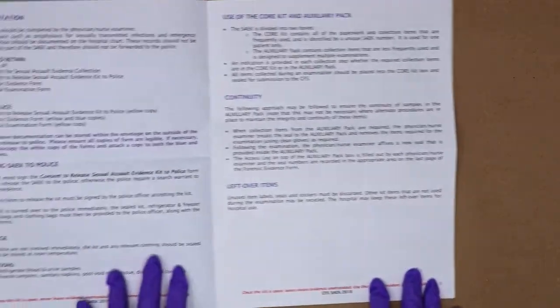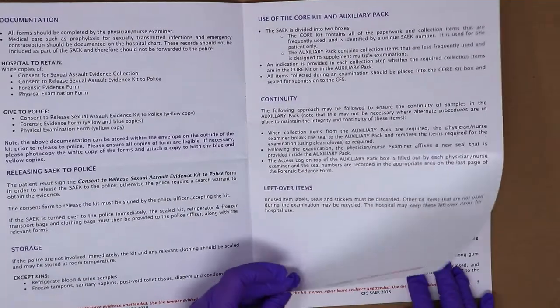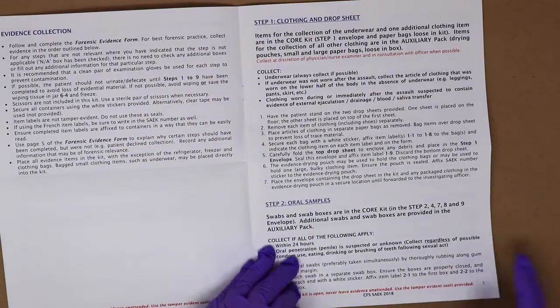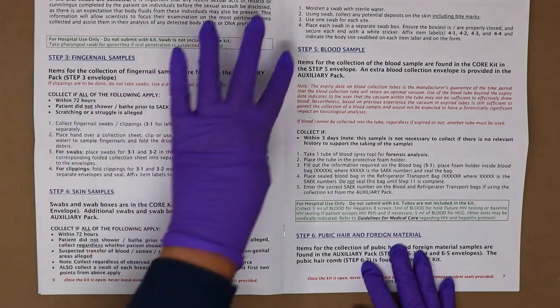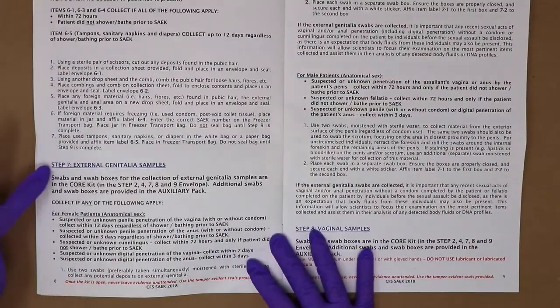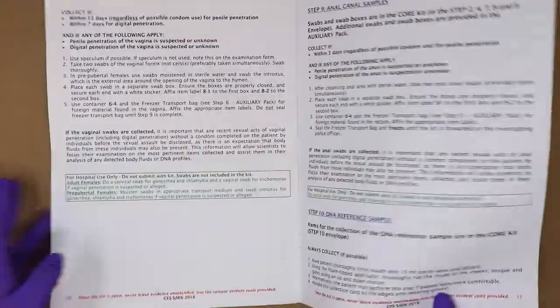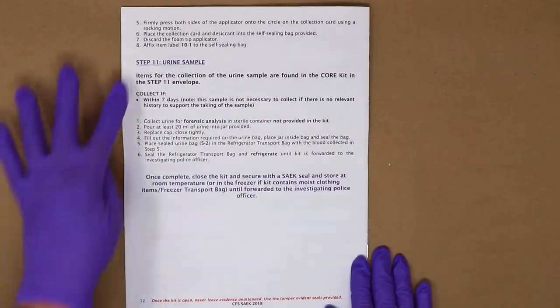The booklet contains information surrounding the documentation, the release of the kit to police, the use of the core and auxiliary pack, and questions surrounding continuity. There are step-by-step instructions for the collection of the kit. The hospital instructions booklet should be kept close by and referred to when collecting each step of the kit. Reassure the patient that this is a normal and routine part of the process. The kit is very large and the collection complex. Referring to these notes as you're going through each step is normal.